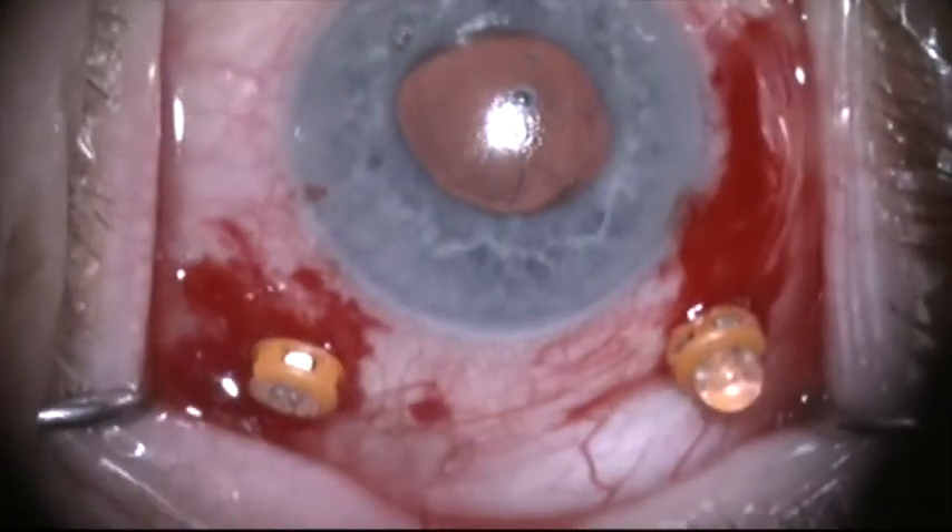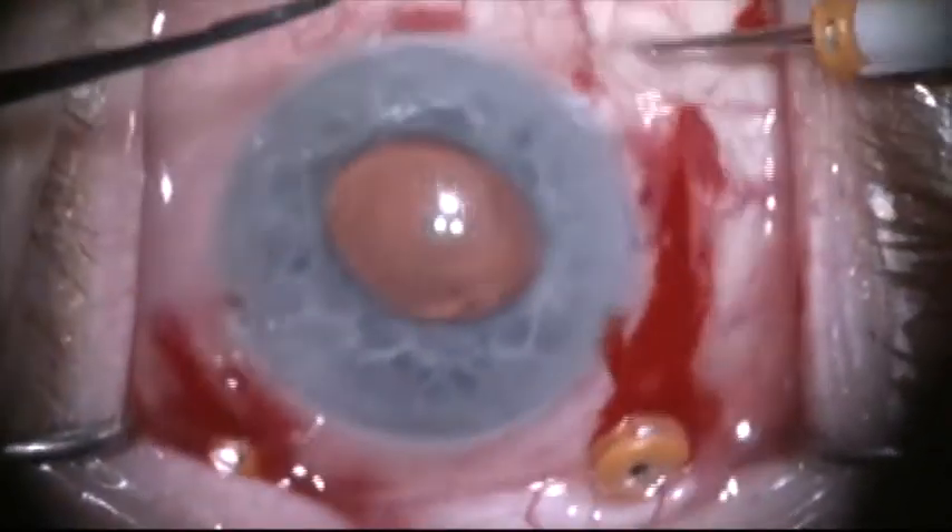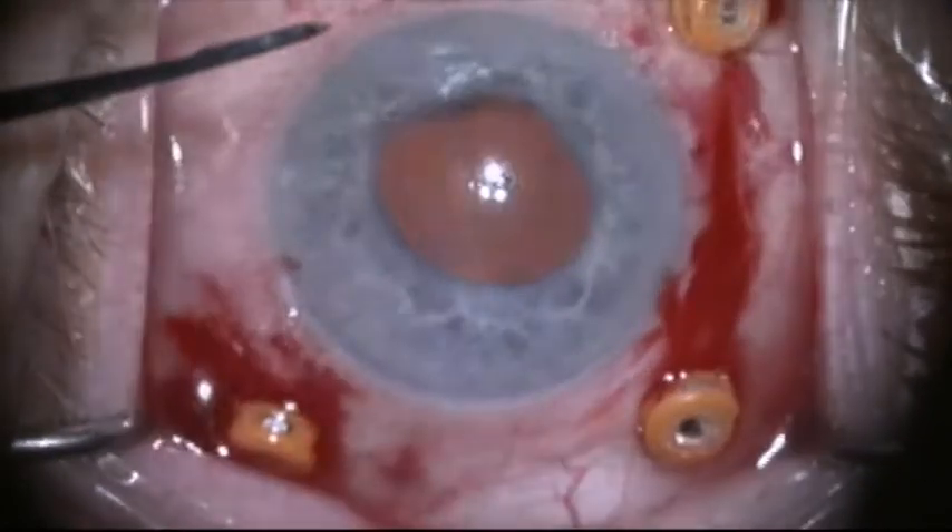I haven't yet decided if I'm going to try to lasso this lens or replace it, depending on what I find when I start doing the vitrectomy. Here I've started my pars plana vitrectomy using the Biome Illumination System. I can see that the lens is now freely sitting on the retina without any support from the zonules at all, so I've made a decision to do a complete vitrectomy, remove this lens capsular bag complex, and replace it with a scleral-fixated intraocular lens.